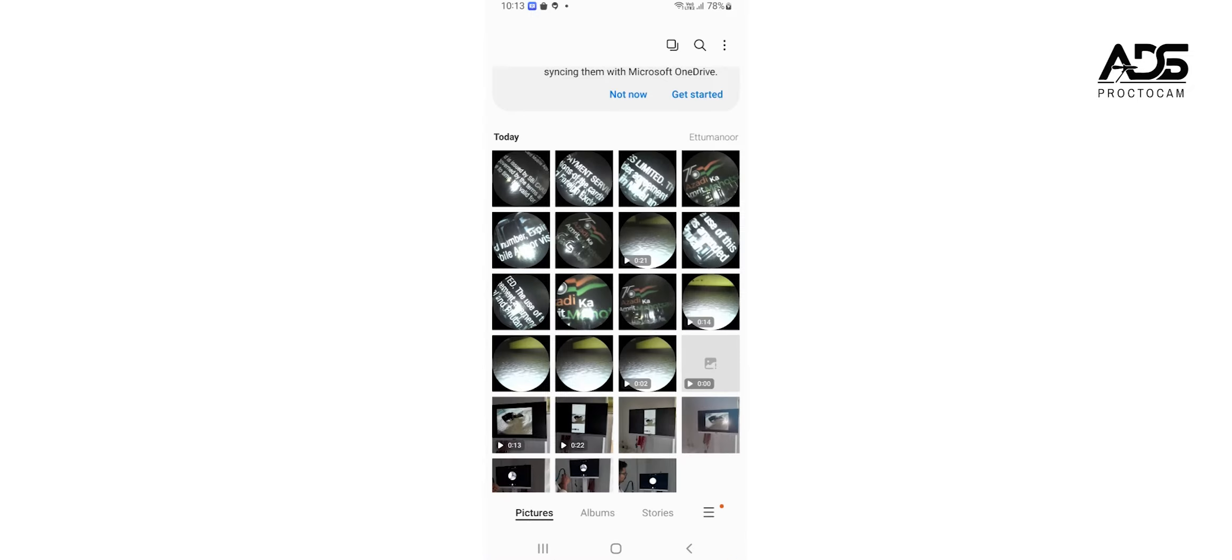You can see all the images and videos are saved in your phone gallery and ready to be shared.